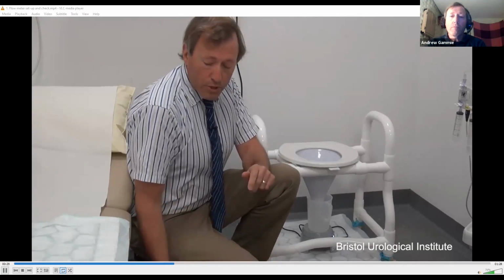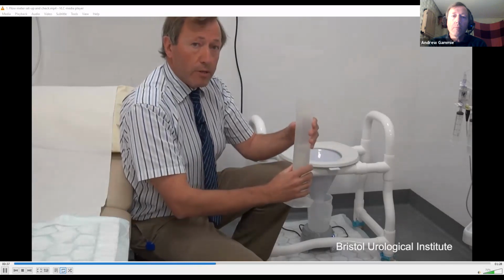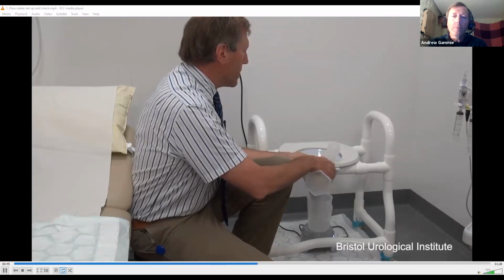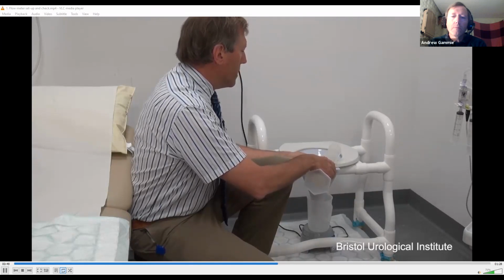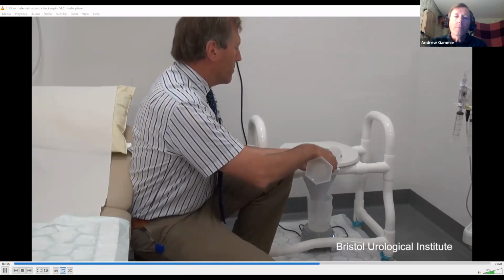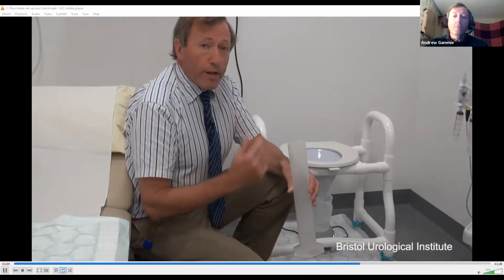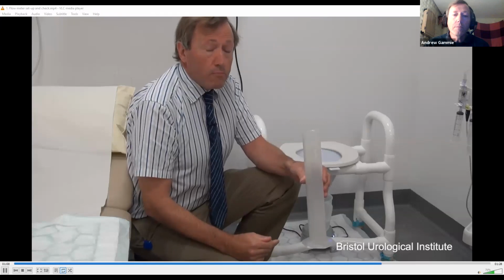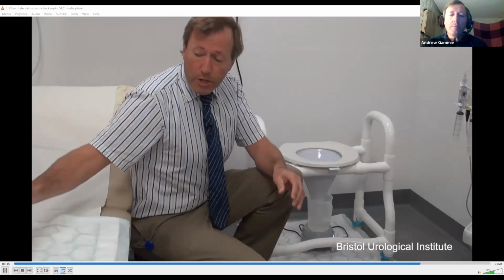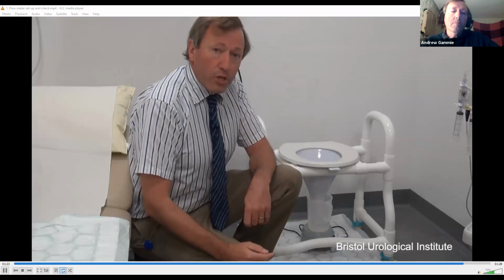And probably every week or so, it's a good idea to check that the flow meter is calibrated. I've got 300 mils in this jug, and I'm going to pour it into the flow meter, pouring it in quite slowly so that it mimics urine flow, and make sure that the whole amount is poured in. I can then check on my screen that actually 300 mils or thereabouts, plus or minus 10 or 15 mils, is registered correctly as the volume. Another way to do this, of course, without the measuring jug, is just to check after the study has been completed that the amount on the screen and the volume that's in the jug match up.